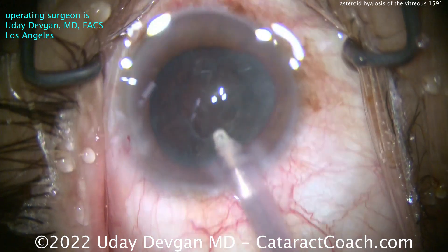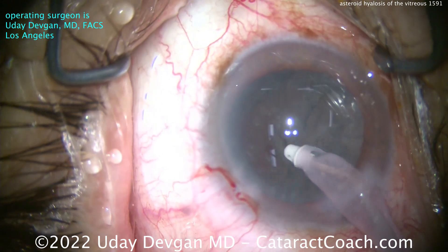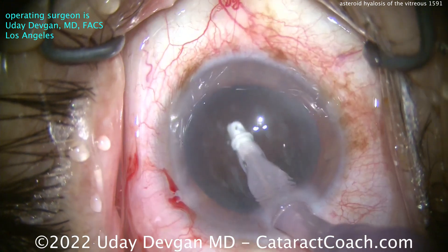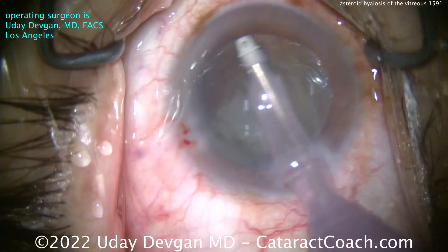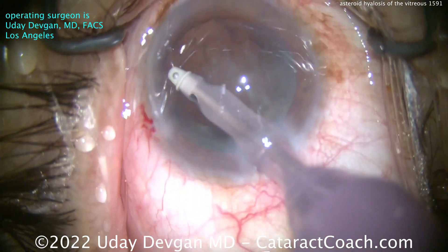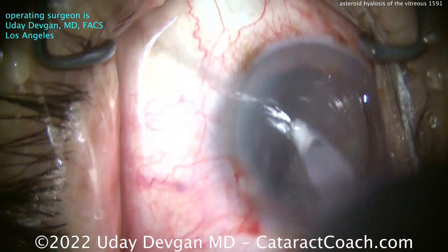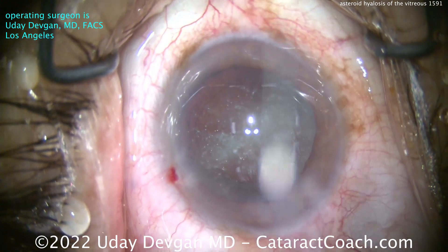No EDOF, no trifocal — none of that for me. Now, as I take the cortex out, here's the neat part: if you look back at the opacities, you can see just during our normal cataract surgery how much movement of the vitreous there actually is. A patient like this who's about 70 years old — you can see the vitreous has really liquefied quite a bit. Polishing up the anterior lens capsule, you can see those opacities, the vitreous, really move around a lot. This vitreous body at age 70 is more liquid than you'd imagine, certainly compared to a younger patient in their 30s or 40s, or even a child where it's almost solid.